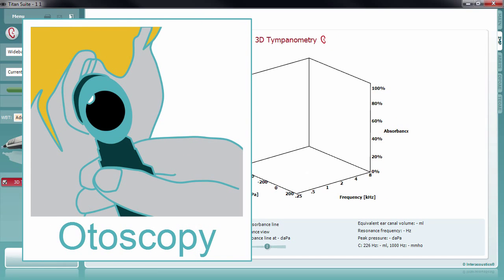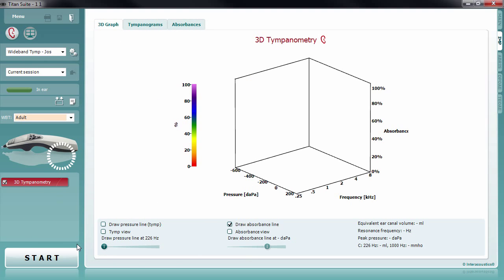After having performed otoscopy, you may insert the probe into the ear. Select an appropriate ear tip that allows inserting the probe while sealing the patient's ear canal.